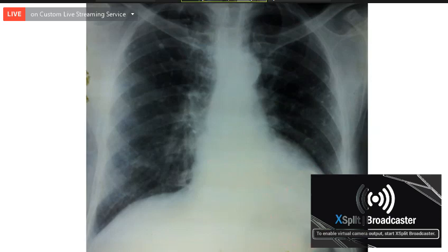And this type of calcification in the left ventricle can happen in patients with LV aneurysm, post-infarction LV aneurysm. So this is a case where the patient had an LV aneurysm and had a calcified aneurysm of the left ventricle. So this is a calcification involving the dead tissue, and that part is not functional. Okay, right.